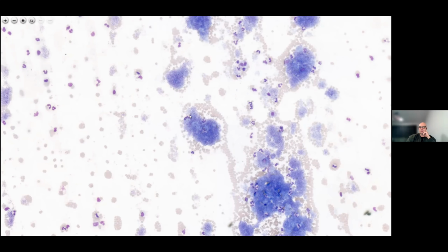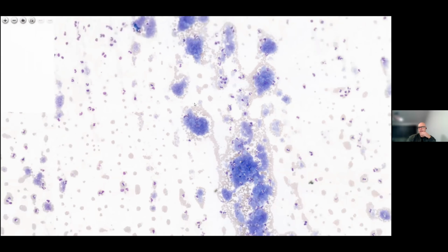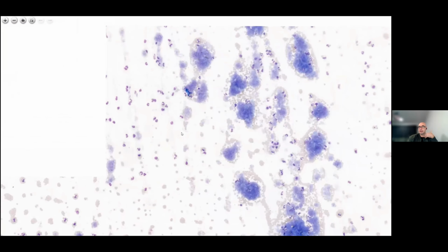Platelet clumping can occur in vitro that is not EDTA dependent, and we'll talk about that a bit later. But you can also get platelet clumping due to improper phlebotomy technique or a difficult collection, like someone's got a hard vein to access and someone's really struggled and tried their best. They've gotten some blood, but it's been traumatic or delayed transferring it to the EDTA sample, and some platelet activation has occurred and partial coagulation has occurred.